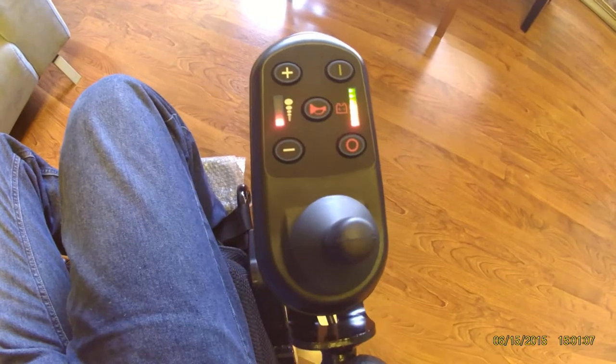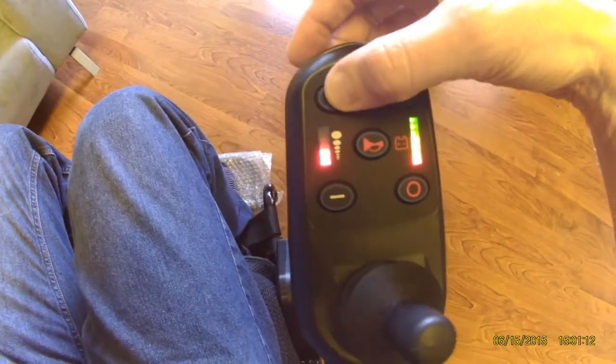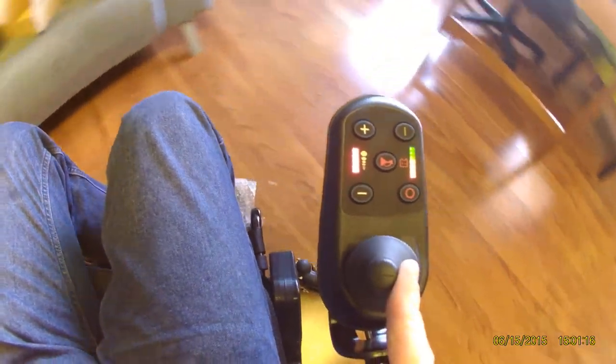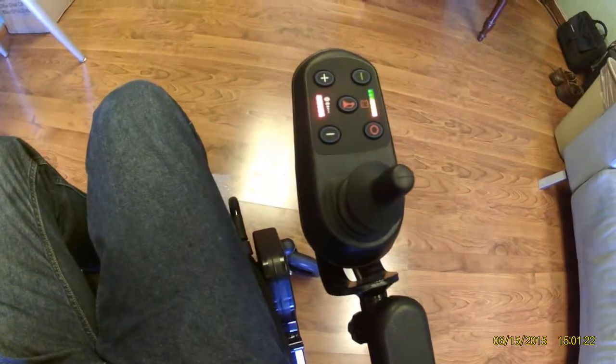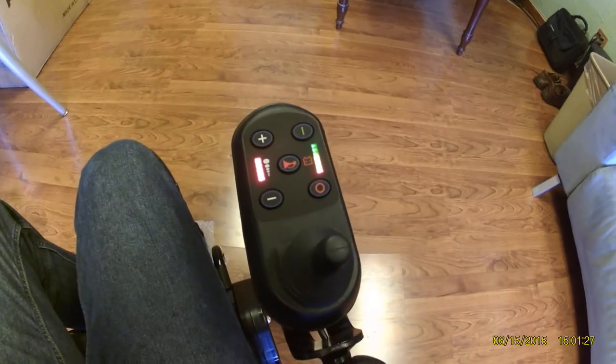I would advise starting slow prior to giving it more juice. At that point, you can understand that the chair has a substantial amount of power, which we will demonstrate in future riding videos.